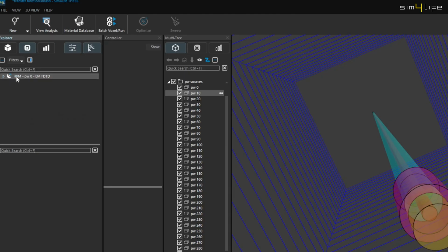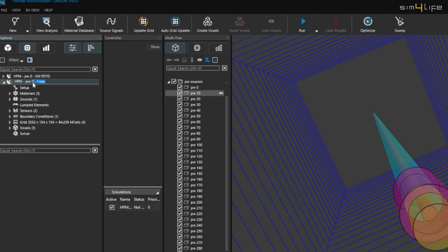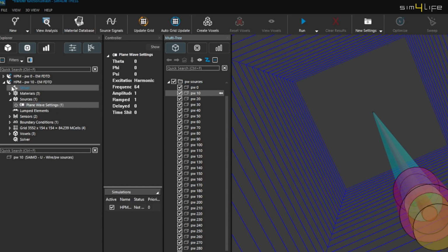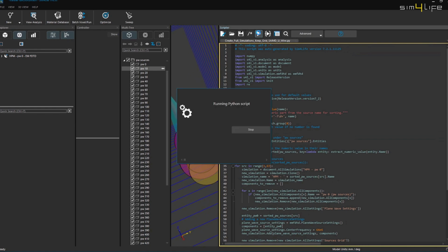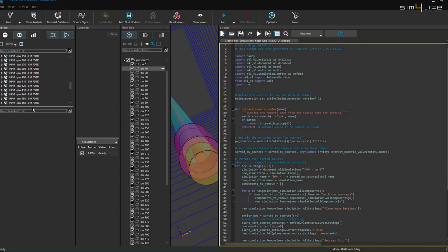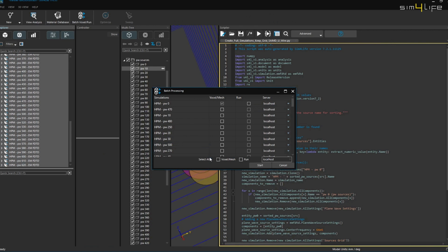To create the remaining simulations for each source along the implant, we have two options. The first is to clone the simulation we just set up and then replace the source. For example, delete PW0 and drag and drop PW10. Next, clone this new simulation and replace PW10 with PW20, and so on. Alternatively, we can speed up this process using the Sim4Life scripting environment, which automates the cloning and source replacement. With all simulations set up, we use the batch voxel run to voxelize and run all simulations as a batch.